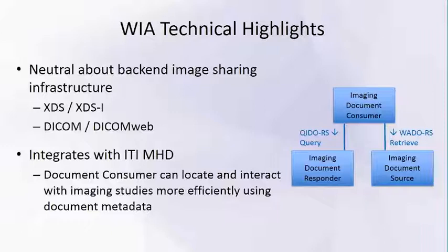From the consumer perspective, it is the same transaction, and one responder may be interacting with a DICOM backend, and another responder may be interacting with the XDS-I backend. But from a consumer perspective, there's no difference. That makes integration much easier on the consumer side.